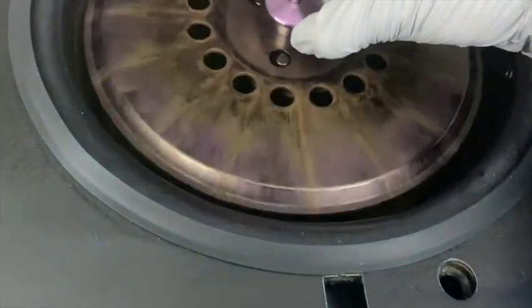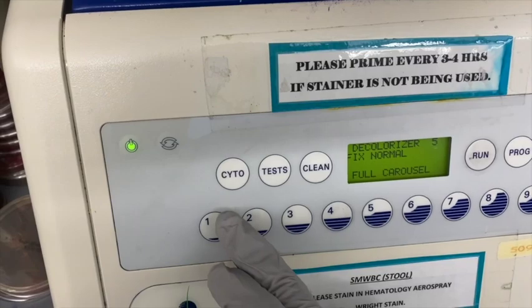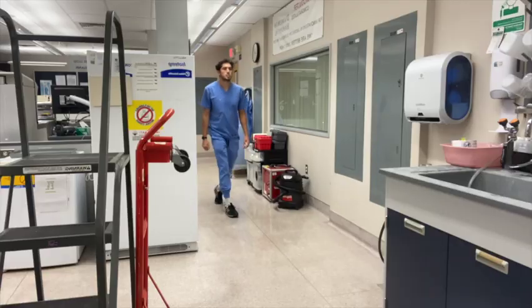I also plate things on gram stains, which are thin glass slides, and then we dye them, which is what I'm doing here. I'm staining it. And this is what the COVID flu test looks like after we prepare it. We go ahead and load it into the PCR machine, which takes about 45 minutes to complete.